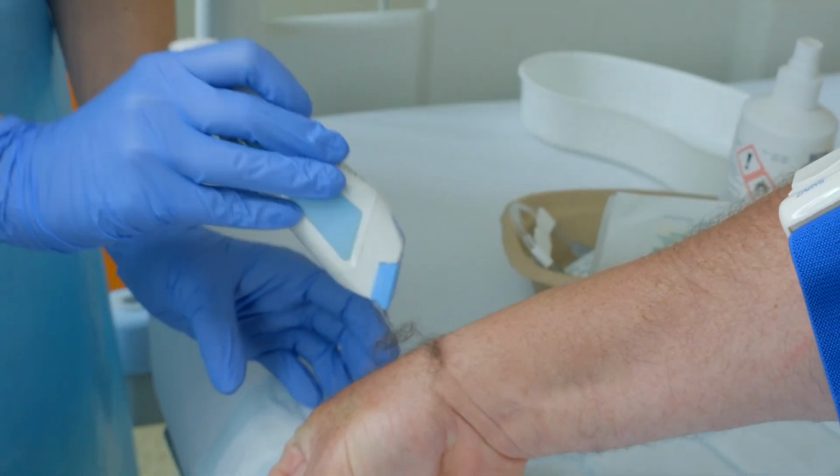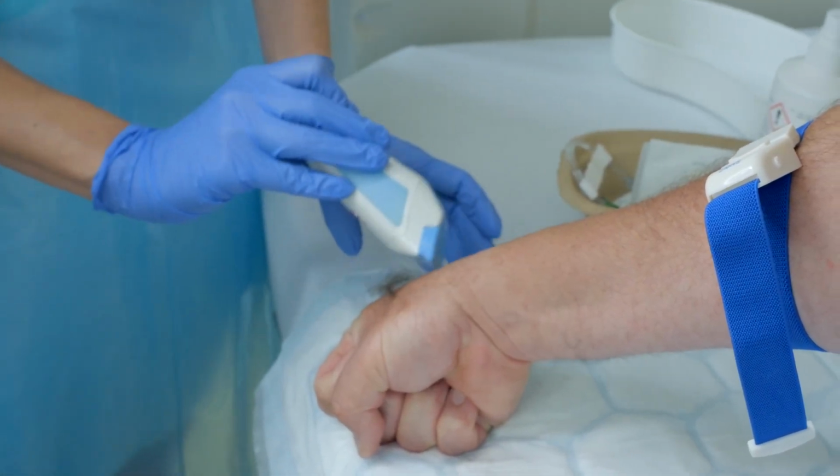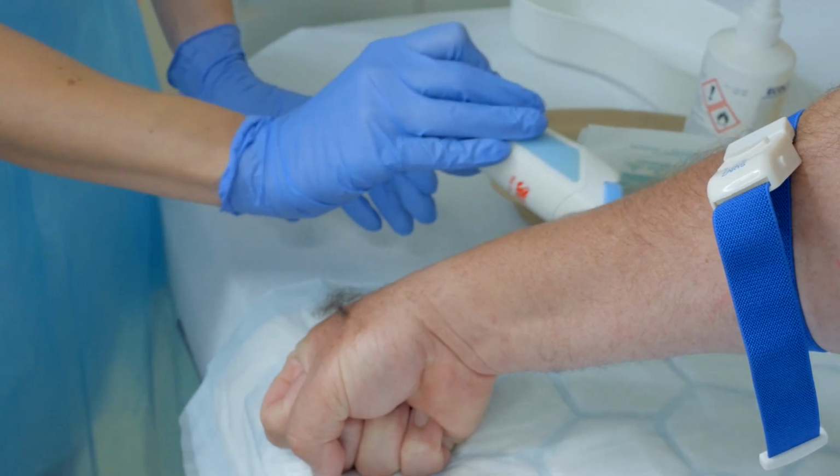There are recommendations to remove hair from the insertion site before insertion. Ideally, the hair should not be shaved but trimmed with a clipper.